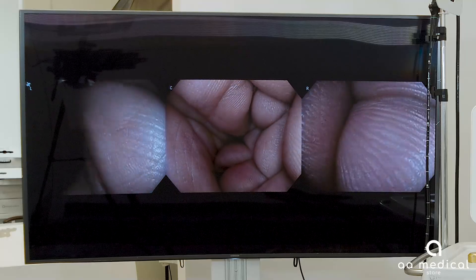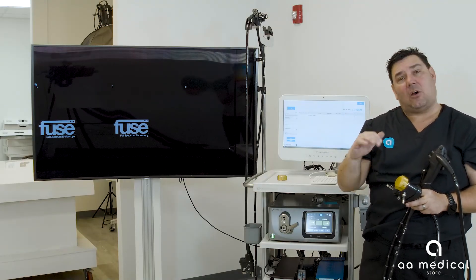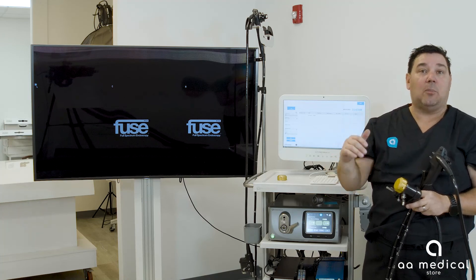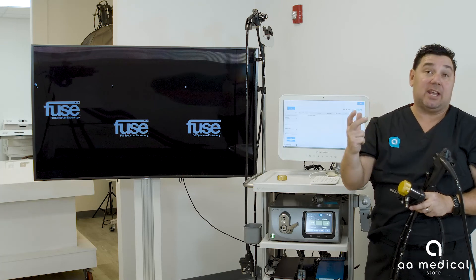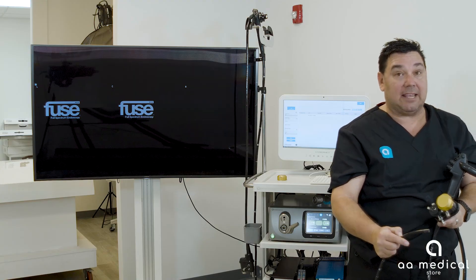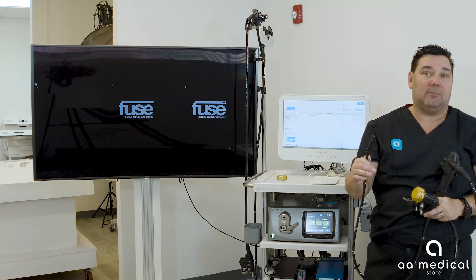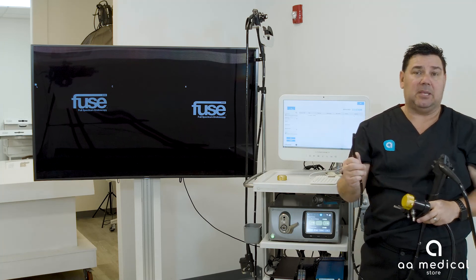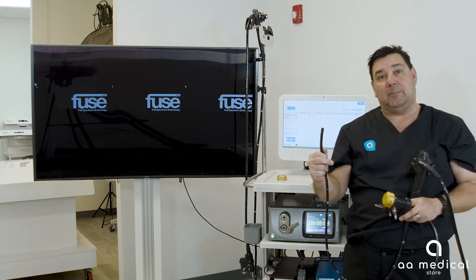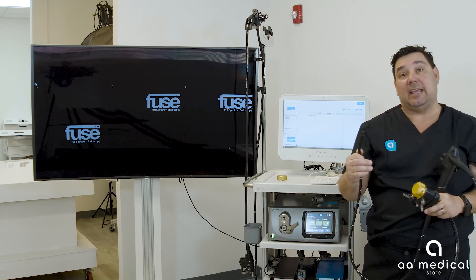Not only does this system have the ability to do colonoscopies, it also does gastroscopies. The main difference between the colonoscope and the gastroscope is that the gastroscope only has two cameras instead of three — a center camera and a right camera — giving you two images on screen. The concept is the same: full spectrum endoscopy. With a typical gastroscope the field of view is about 145 degrees; with the full spectrum it goes to 245 degrees, giving you much more viewing area to detect abnormalities in the stomach.